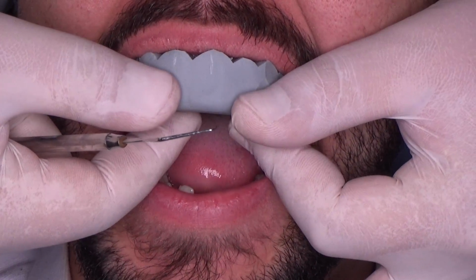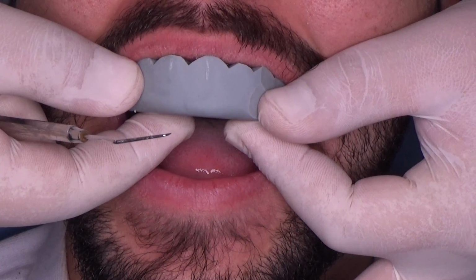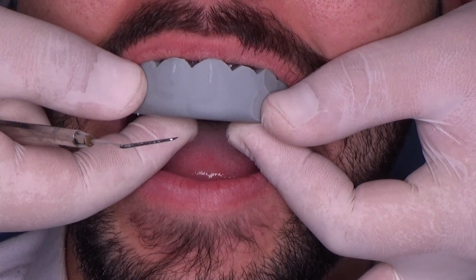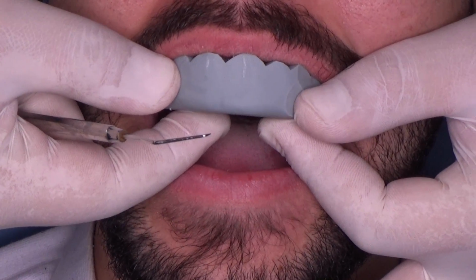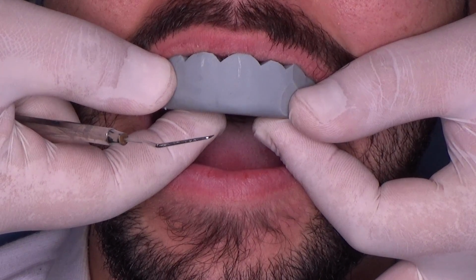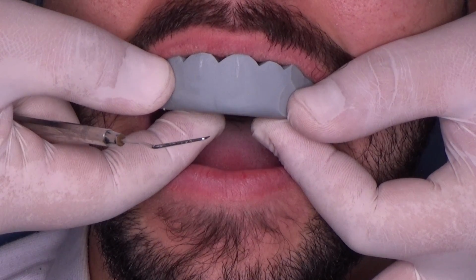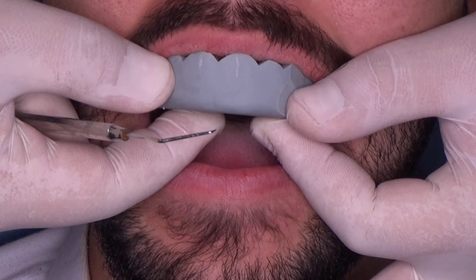So this mock-up, if it's a veneers case, you will use it to prepare the case and prepare through the mock-up because it's an additive case, no? Yes, this is completely an additive case, so we can prep through the mock-up. Okay. So in this case, we had to add some composite on the incisal edge.